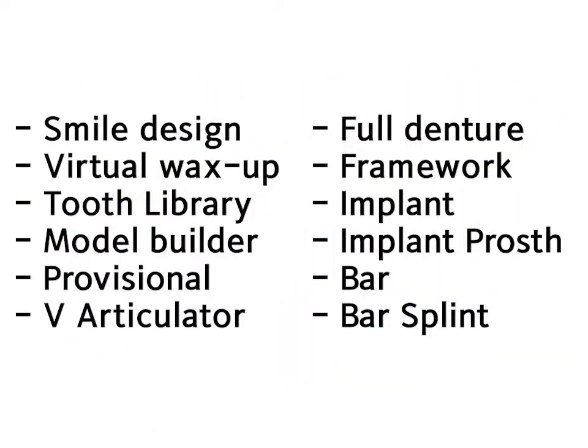The next one is a bar module. This module usually includes a library of different types of bars that enables custom design of bars for overdentures. These designs can range from simple bars with standard cross sections, such as a Dolder, Hader, or Ackermann section, to bars for complex cases where additional attachments and retentions can be added. Prefabricated attachments consisting of cylindrical holes, or even arbitrary geometries with various paths of insertion, can be added to this design.